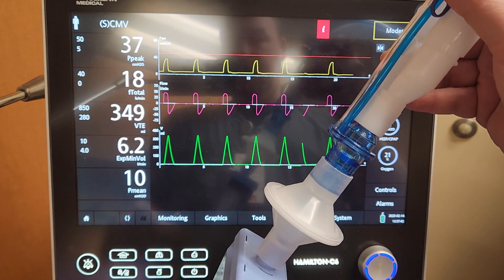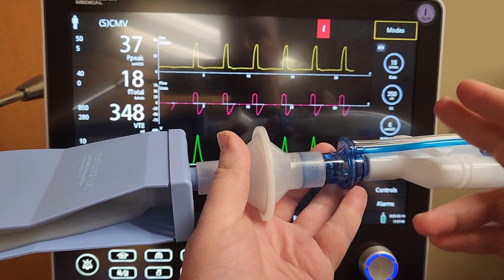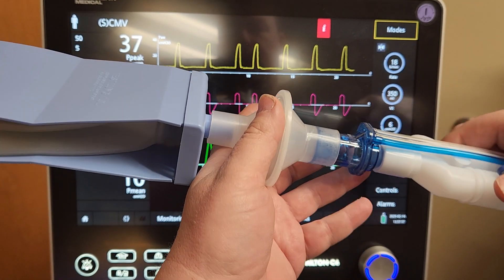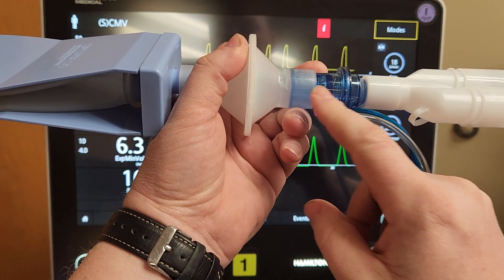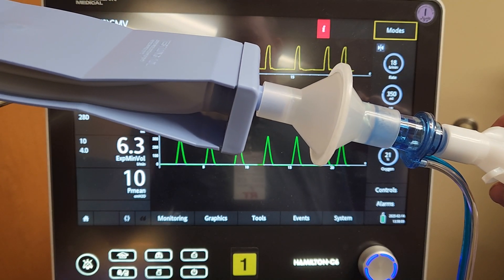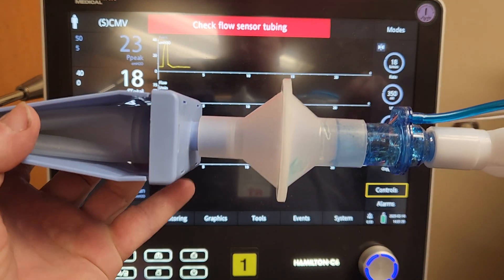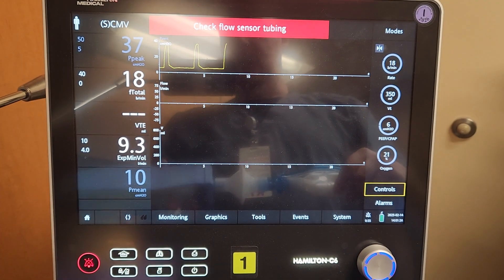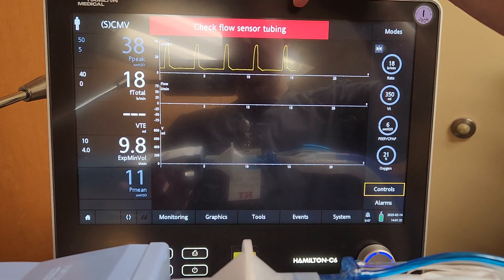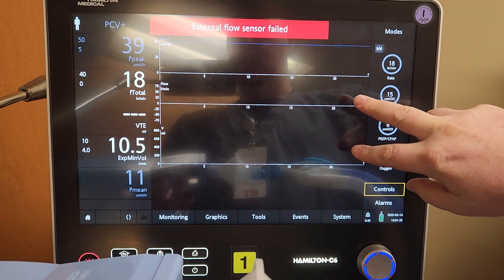What commonly happens is if this sensor gets fluid in it, it will say flow sensor failure or flow sensor circuit fault. I'll demonstrate: I've put a flow sensor in here with a whole bunch of ultrasound gel in it. Since it's completely occluded, it says 'check flow sensor tubing,' then 'flow sensor tubing failure' or 'flow sensor failure.' You can see two waveforms are completely missing — the external flow sensor has failed and it has switched modes.